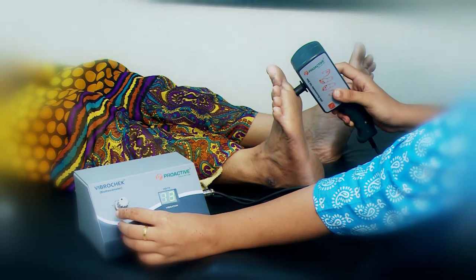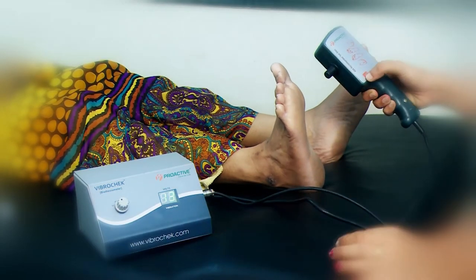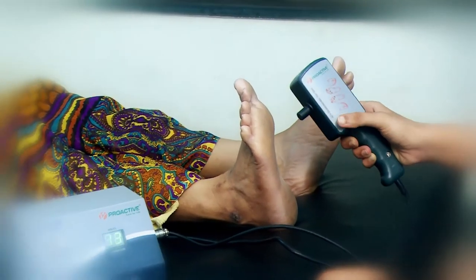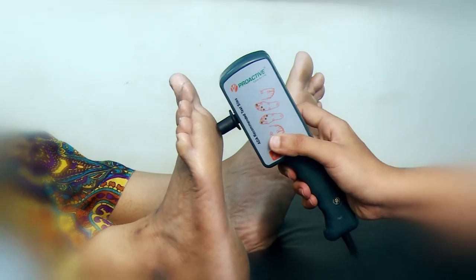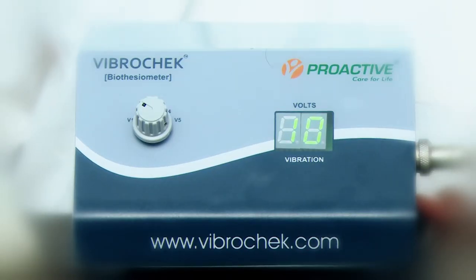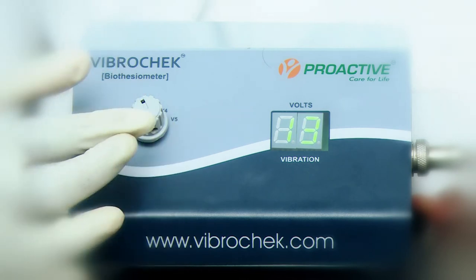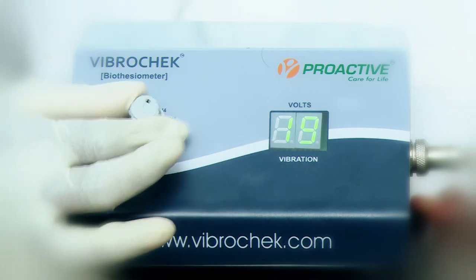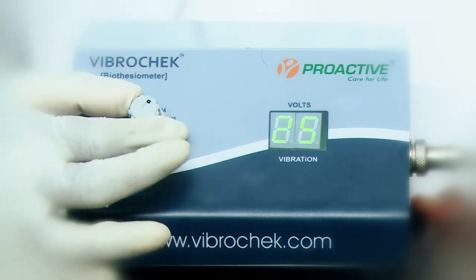A check button provided on the handle creates a placebo situation. Press this off and on so that you can verify the patient's correct response to the sensation. Please note: VibroCheck has 5 vibration perception threshold points, V1 to V5, which give continuous vibrations as per the tuning fork frequencies — V1: 10V, V2: 13V, V3: 19V, V4: 25V, V5: 31V.